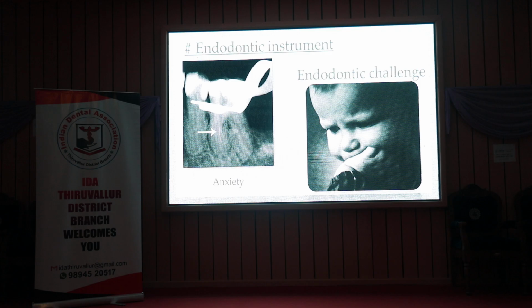Being an endodontist or a specialist, of course I should admit that the last time I broke one was probably a couple of years ago, because I take all the precautions so that I will not break it. Still I can't be 100% sure, because of the anatomic challenge you have.